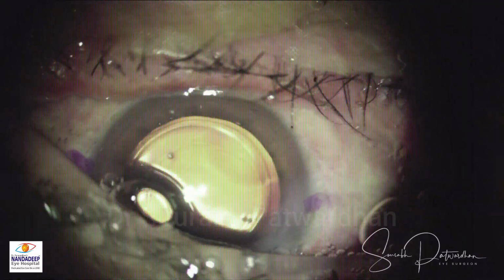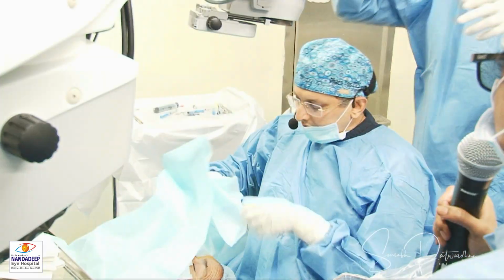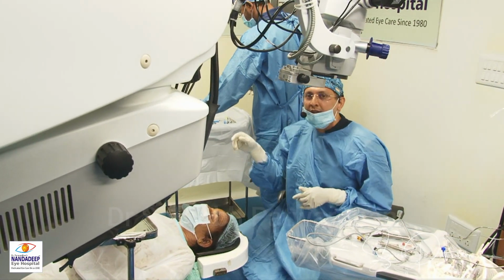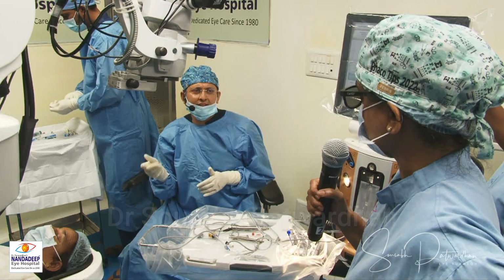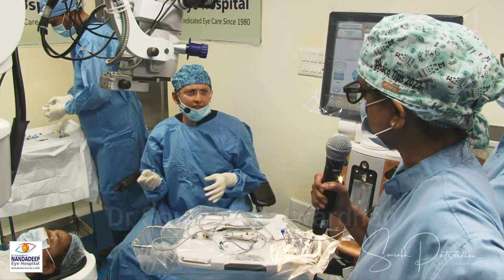Dr. Sourabh, do you take any precaution to see that there is no post-op rotation? Yeah, so generally in my experience, we see the patient after 1 week directly. We don't see next post-op day. And even if there is significant rotation, which means that the residual cylinder is say more than 0.75, we can consider re-rotation. But in my experience, if the patients are quite comfortable with post-operative vision, I don't generally advise a second intervention.